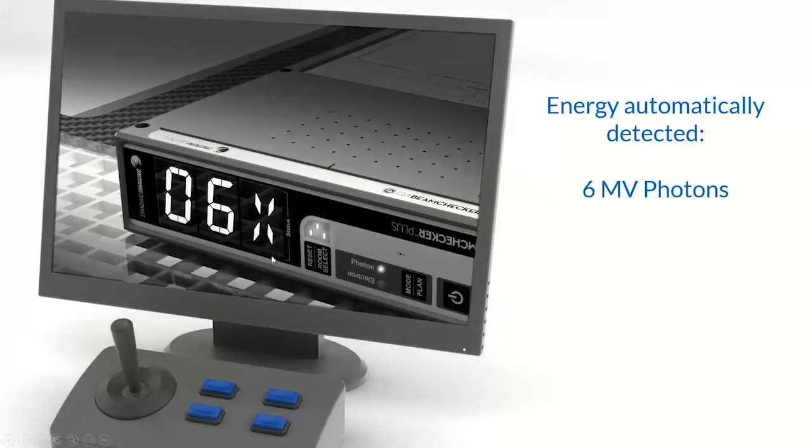In this example, we automatically have detected, say, 6 MV photon energy. And we can say, okay, the device has indicated, based on the energy score, which is stored inside here, it knows what a 6 MV beam's constancy, flatness, and symmetry were at the time that I baselined it.